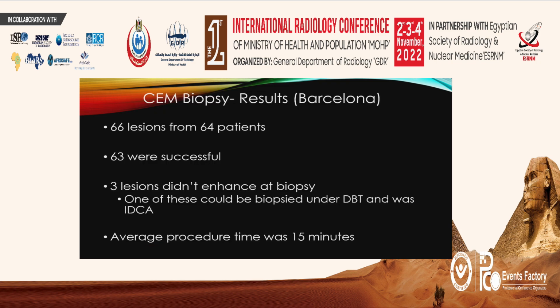Here are the results of their study. They looked at 66 lesions from 64 patients and were successful 63 out of those 66 lesions. 3 of the lesions didn't enhance. They were able to biopsy 1 of them anyway because they could see it under tomo. The average procedure time was 15 minutes.